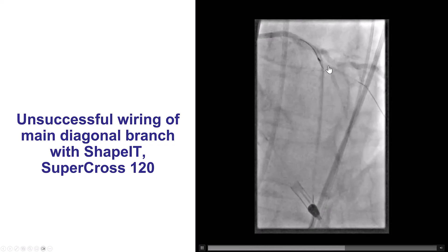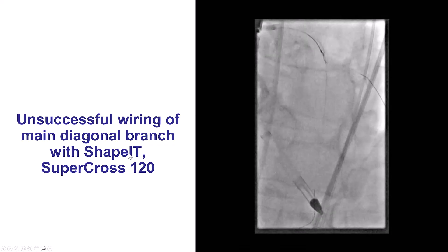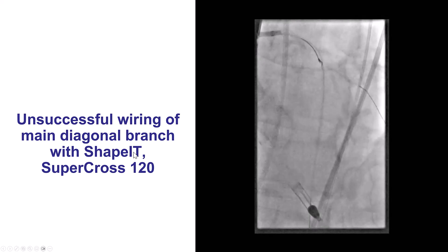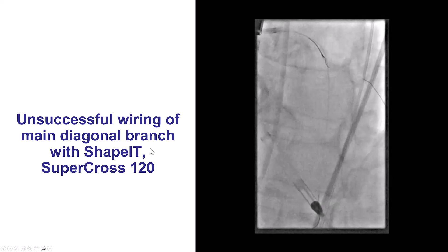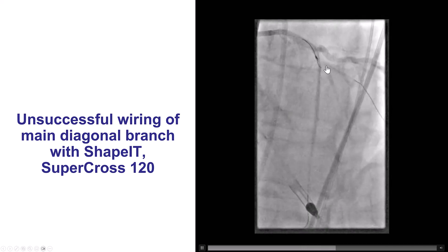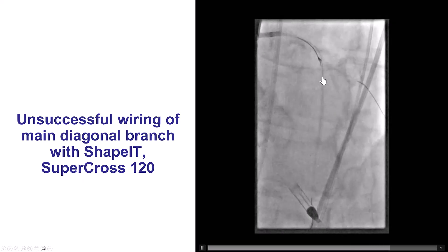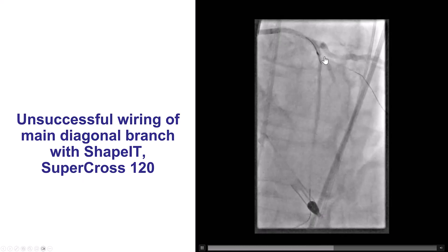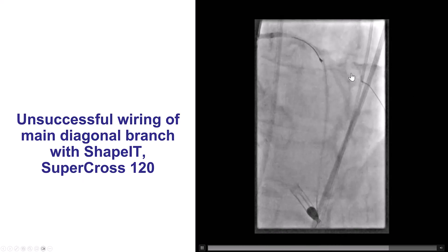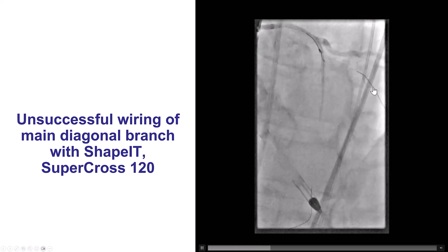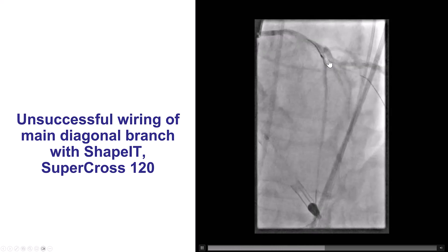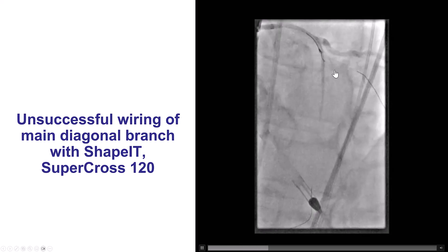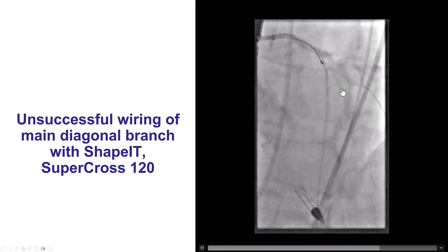We initially tried with different techniques. We tried with an angulated microcatheter, the Shapit from IMDS, as well as the Supercross 120, but every time we did this, the wire kept on going into the superior branch. We have a wire in the superior branch, but we are unable to get a wire into that more inferior branch of the diagonal.